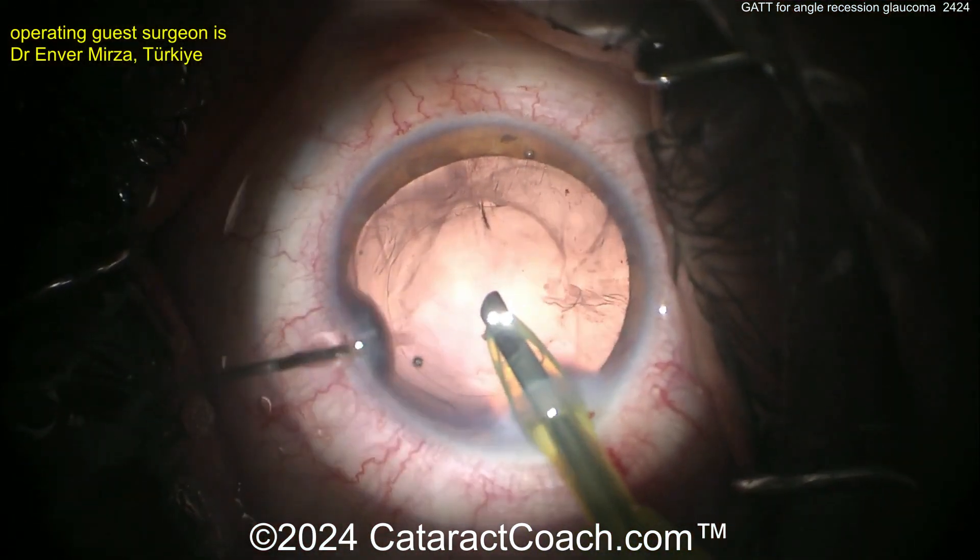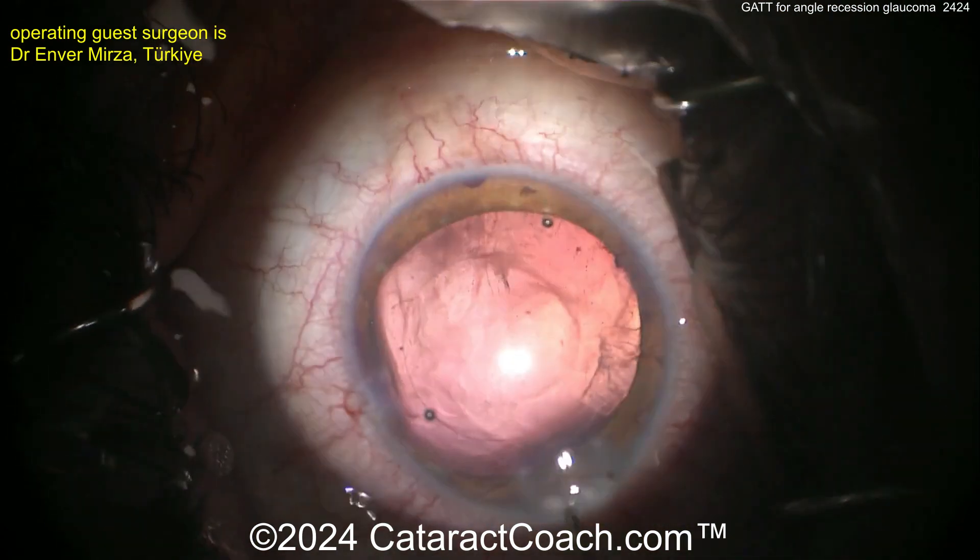Now let's see — a little more viscoelastic going in. Take the probe out of the eye.